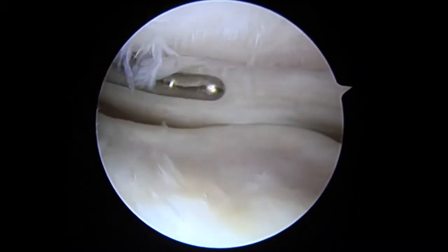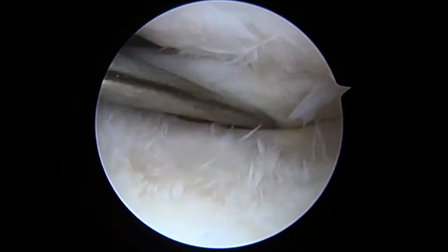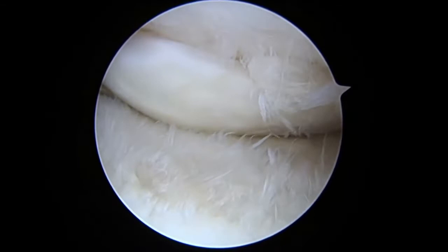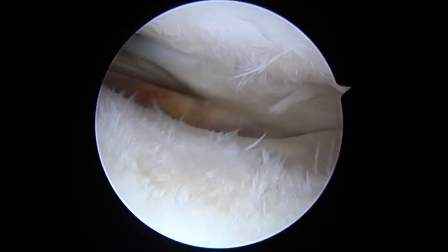The arthroscopic view from the anterolateral portal shows a decreased volume of the lateral meniscus due to a previous surgical resection. The posterior LM is then pulled anteriorly over the center of the lateral compartment by probing.